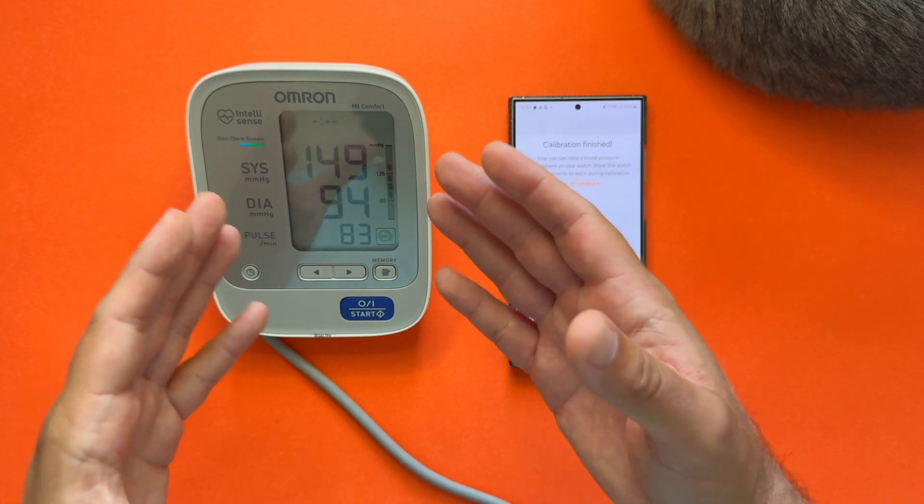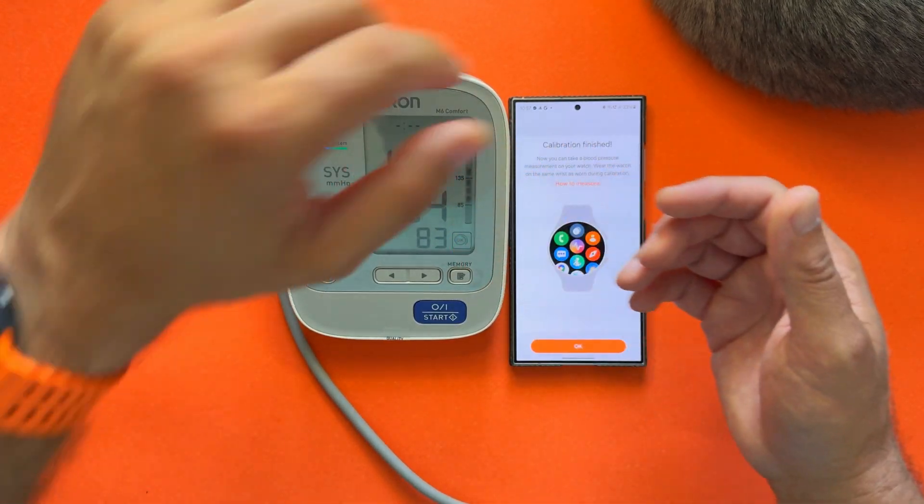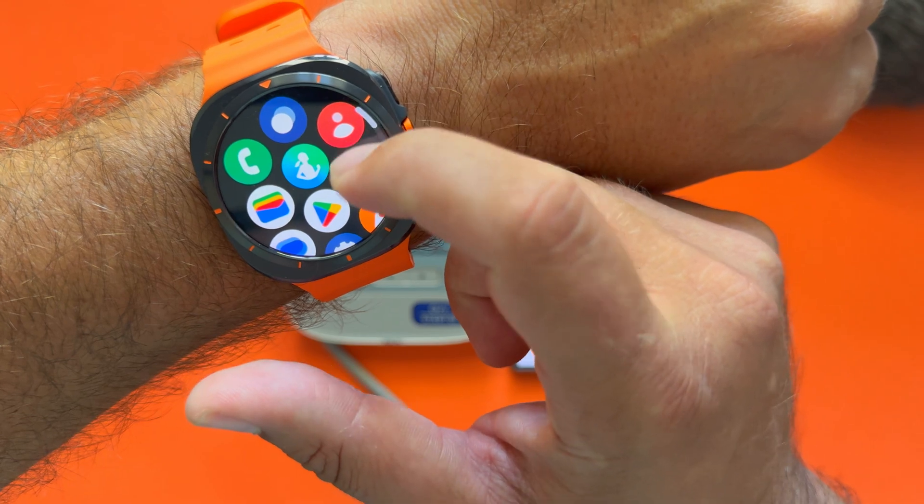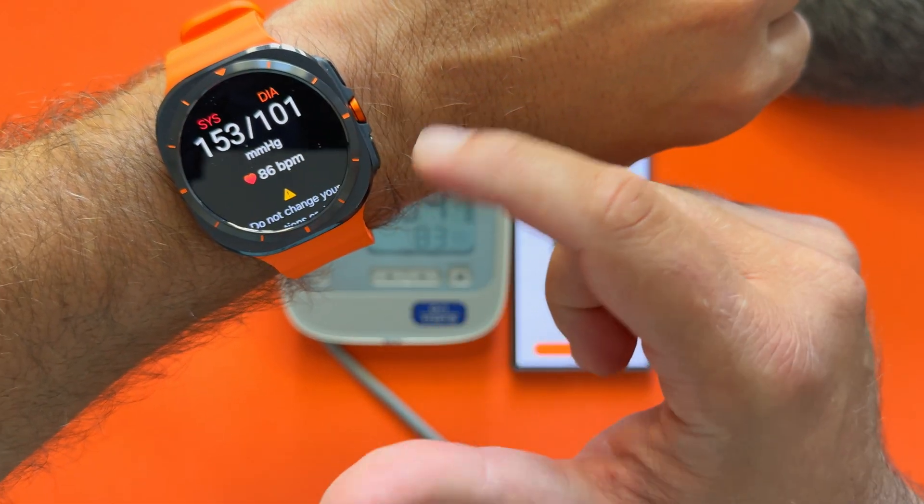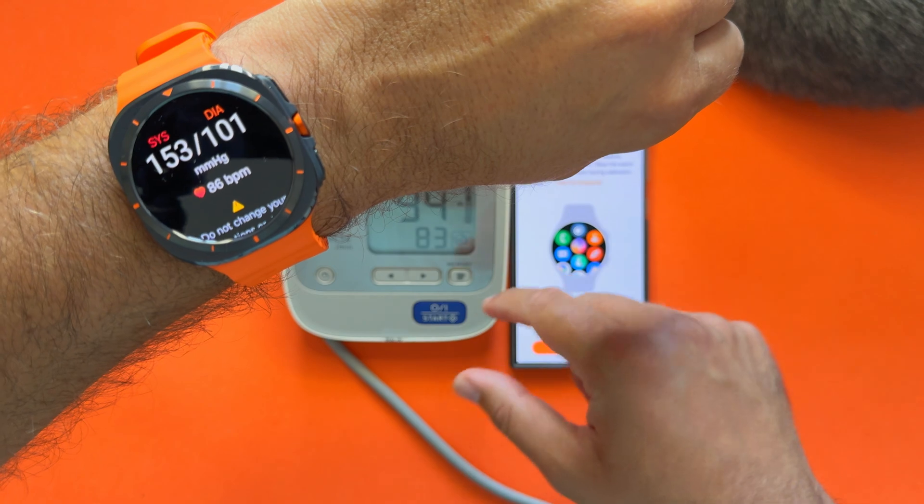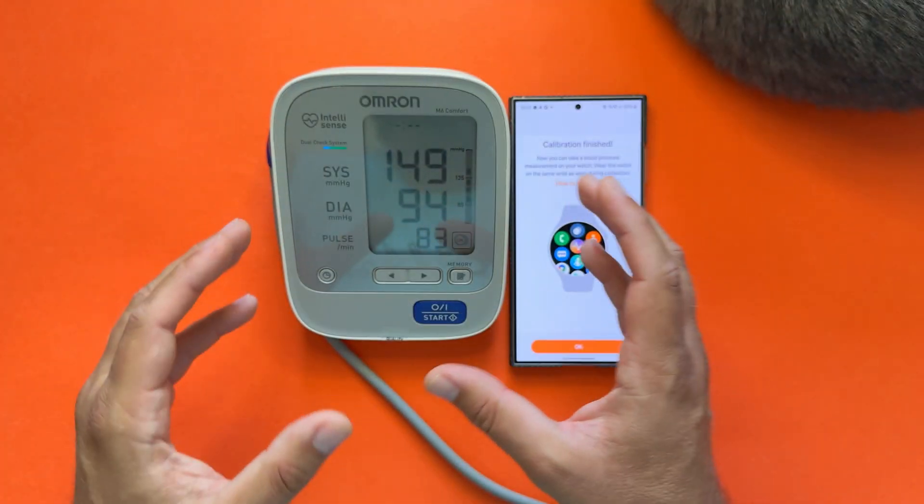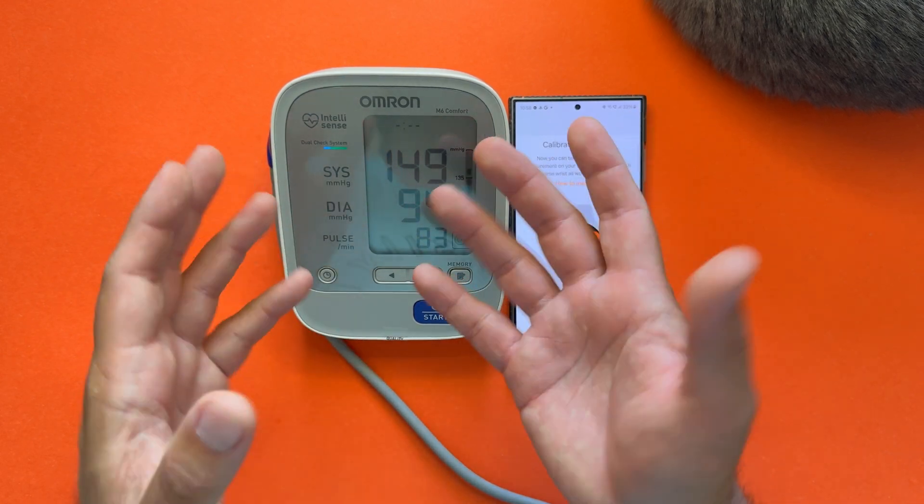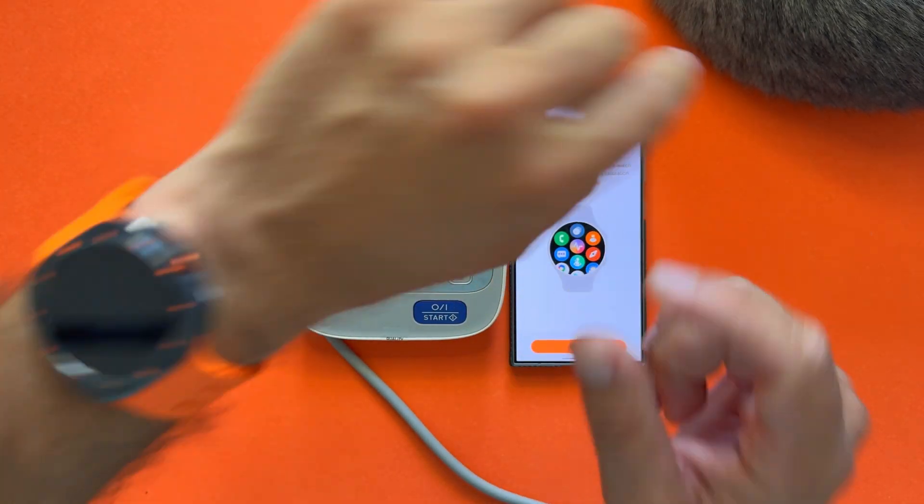So the Omron M6 Comfort blood monitor reported 149 over 94 and 83, and the watch—remember the watch did 153, which is actually not so far away, 101 a bit more far away on the diastolic, and the BPM was I think circa the same. You will not get really the same results all the time, but right now, again, I took coffees in the morning, so this was probably not the best time to calibrate it.